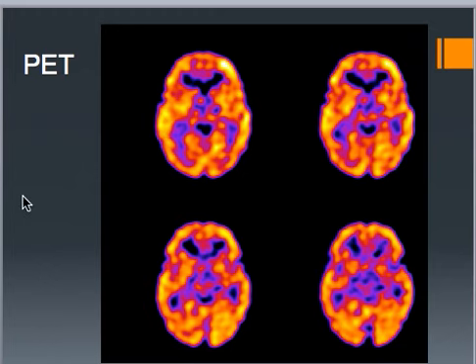A brain tumor will usually show up darker, as well as Alzheimer's and dementia. Those have larger areas that are darker. I have an image I'll show you later, but a larger dark area would indicate Alzheimer's or dementia. The dark areas signify areas of the brain that have been impaired.